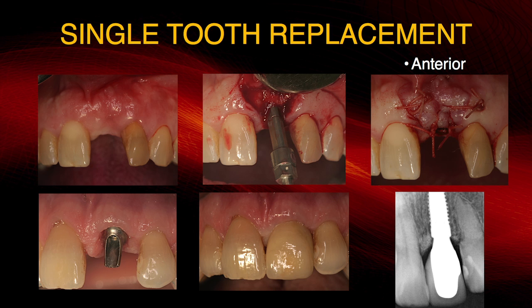So here you can see again this incision where we're coming around from the mesial so we don't disturb the papilla here, and we come around the lingual, taking this lingual palatal part of the tissue and bringing it up forward and placing the implant. This picture here is actually at second stage uncovering, where we're doing the same thing, placing this tissue here and placing a healing abutment.